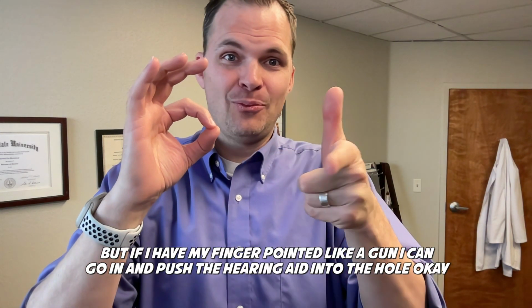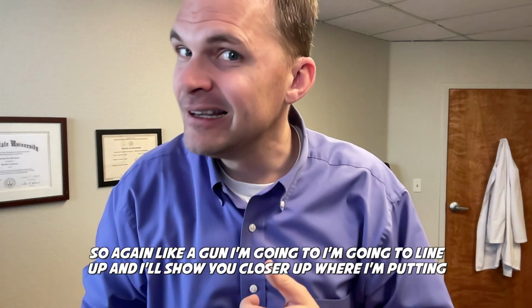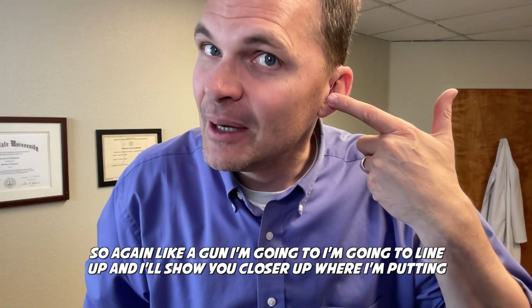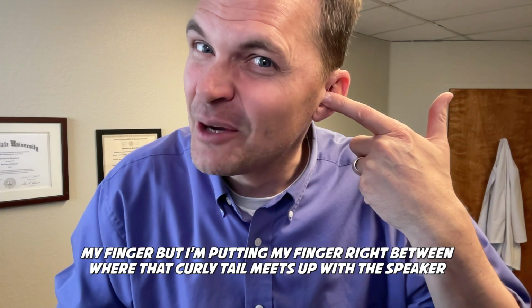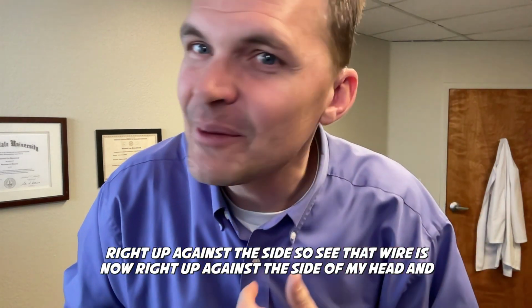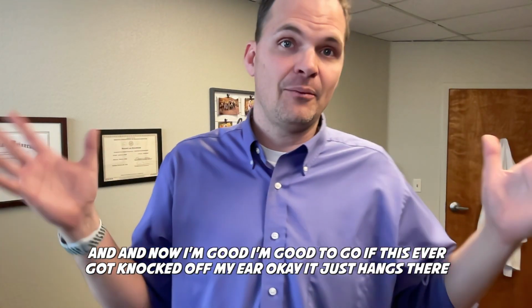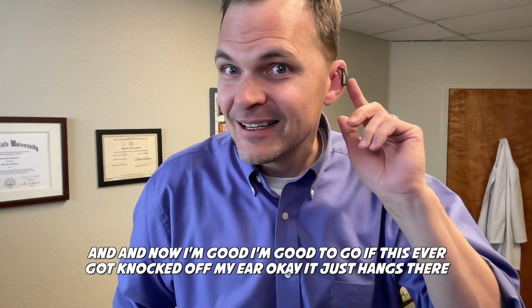But if I have my finger pointed like a gun, I can go in and push the hearing aid into the hole. Okay? So again, like a gun, I'm going to line up, and I'll show you closer up where I'm putting my finger, but I'm putting my finger right between where that curly tail meets up with the speaker, and I'm pushing it in towards the back. And it's going to slip in, that wire is going to be right up against the side. So see that wire is now right up against the side of my head, and now I'm good to go. If this ever got knocked off my ear, okay, it just hangs there.